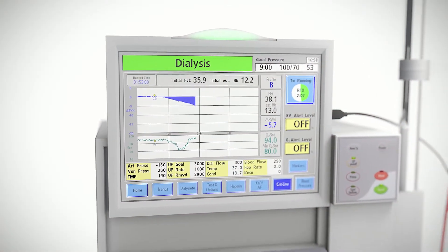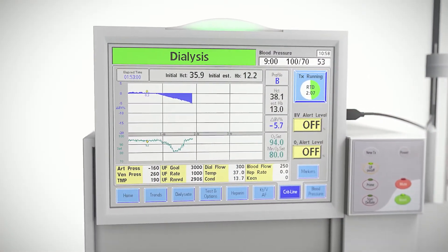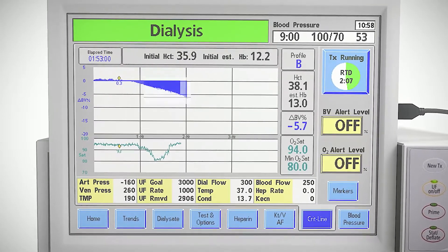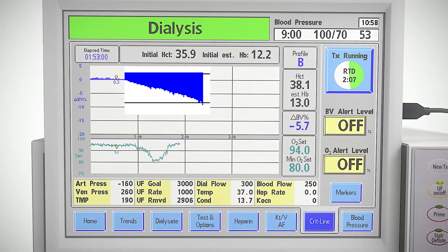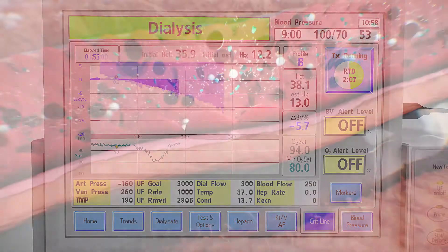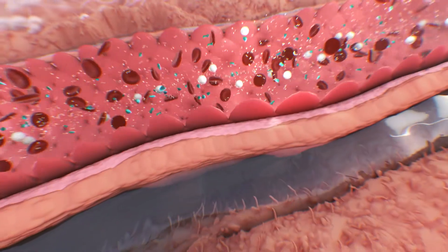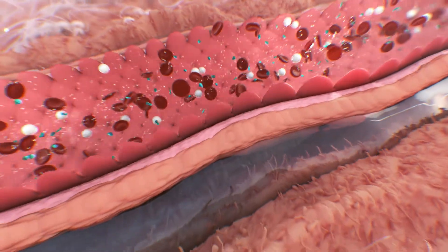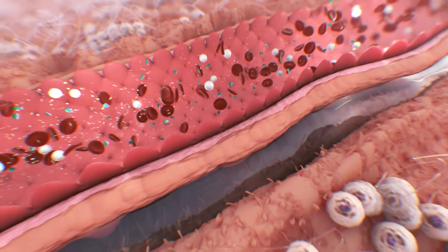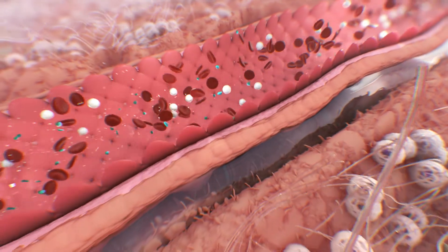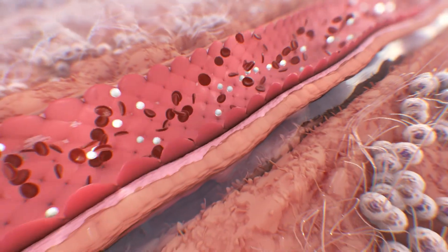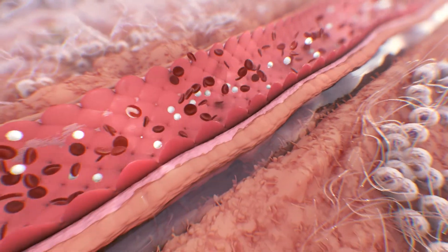Profile B is represented as a gradual slope and has been targeted to find the best compromise between a high ultrafiltration rate and the prevention of intradialytic symptoms. Profile B indicates that the patient's plasma refill rate is slightly less than the rate of ultrafiltration and hemoconcentration of red blood cells is increasing. The ideal slope is not a fixed percentage of change in blood volume and can vary from patient to patient.